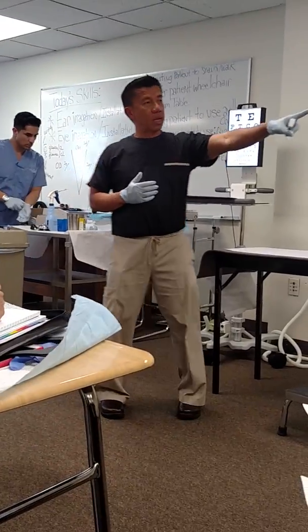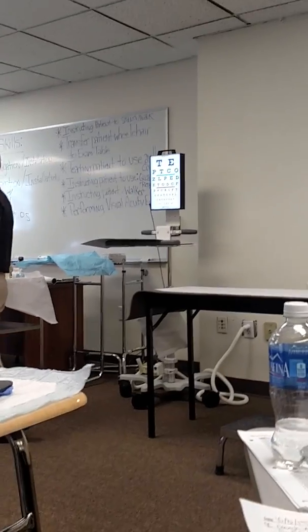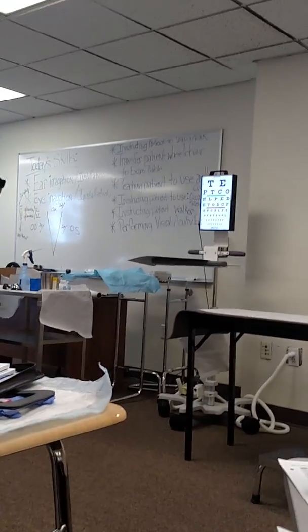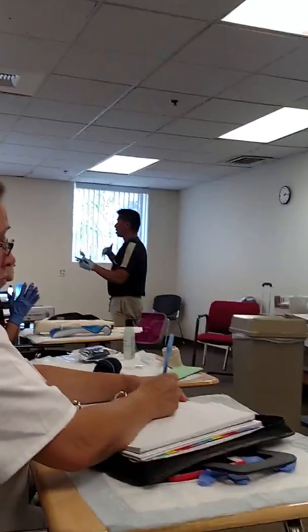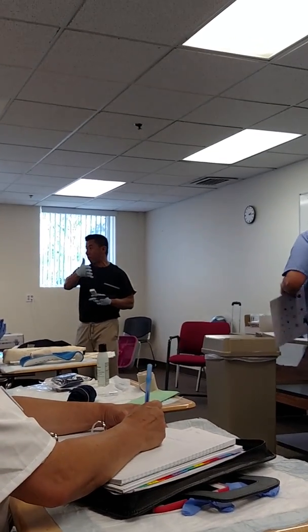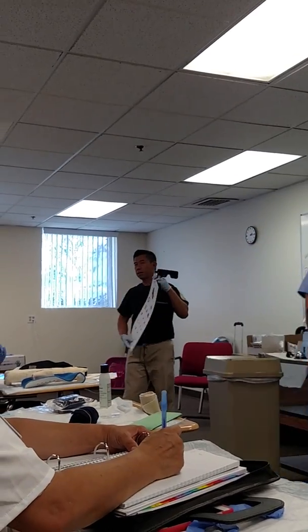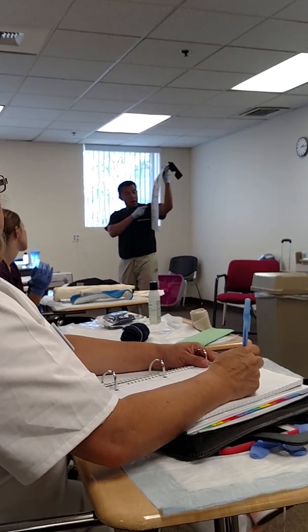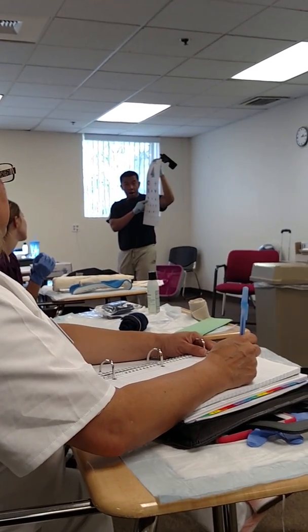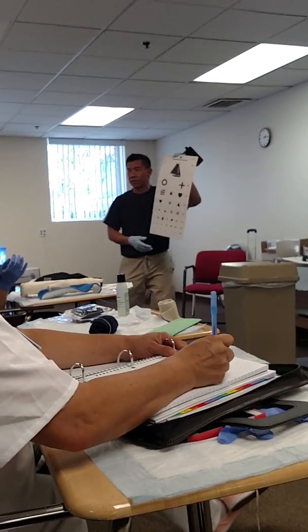So right now, what we need is your chart. This is the Snellen chart. There are some patients that are not able to identify their alphabet. Then you have this big E tumbling chart. It's like the big capital E, just tumbling all over the place, and it gives you the hand signal, pointing upward, sideward, downward. Or they have some little objects like this for the pediatrics. This is the way you test the kids, like, hey, can you tell me what this is? A heart! So that's how you keep it animated when testing for the visual acuity.